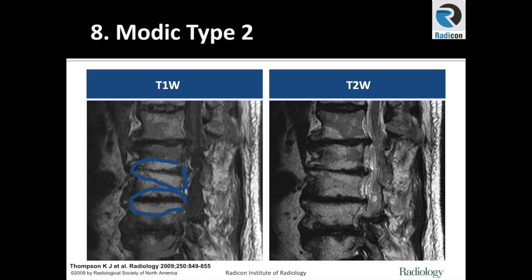Let's look at this case. T1 images on the left and T2 weighted images on the right both show hyper-intense or bright end plates, which is Modic Type 2 change. If it's bright on both T1 and T2, it is a Type 2 change, representing fatty replacement following prior inflammation seen in Type 1 changes. In Type 3 changes, end plates appear dark and hypo-intense, representing sclerosis after the initial phase of inflammation, then fatty replacement, and the final stage of sclerosis.